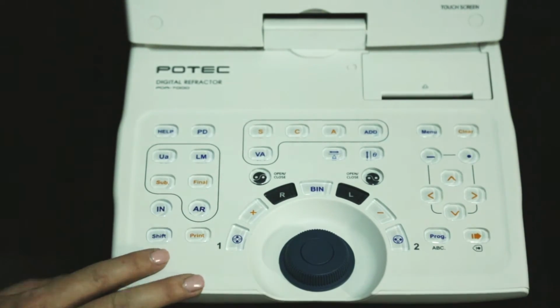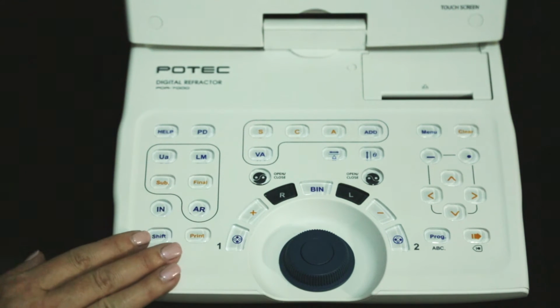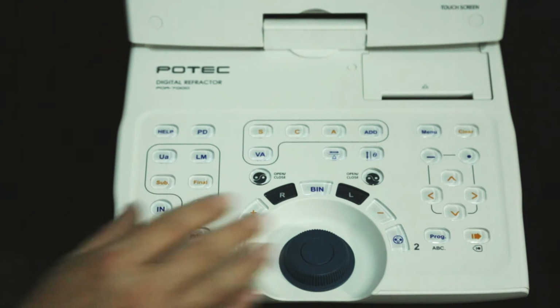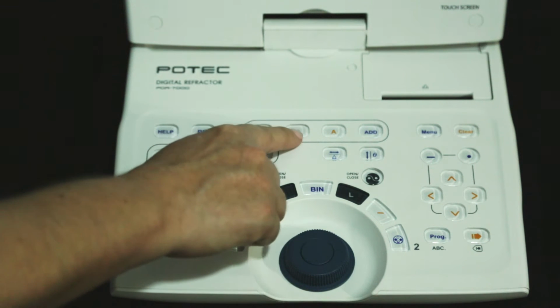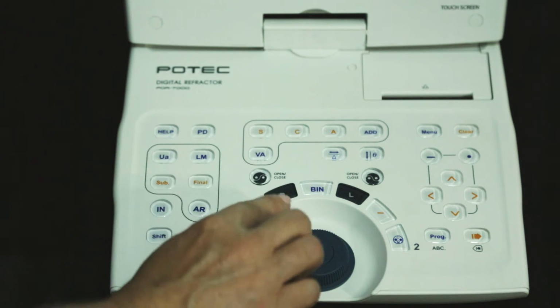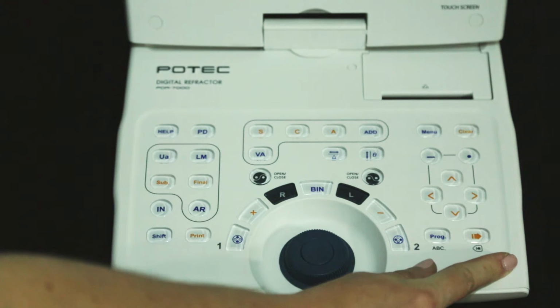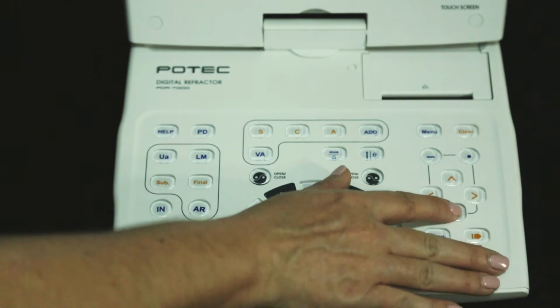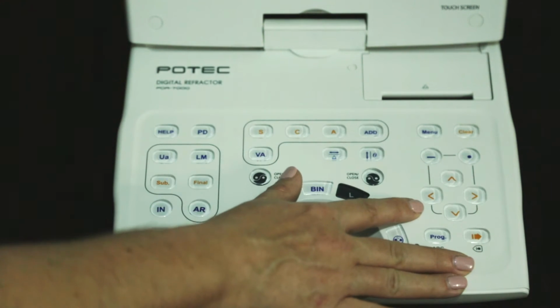The control panel can be divided into three sections. First is your data section. This is where you'll input all of your pre-test data, your subjective, and your final exam. In the center are your lens controls. This is how you will move from sphere, cylinder, and axis, right eye and left eye, and increasing and decreasing in diopters. On the right-hand side, you've got your chart controls. This is where you can isolate a line, move up and down an optotype size, and isolate a single letter.